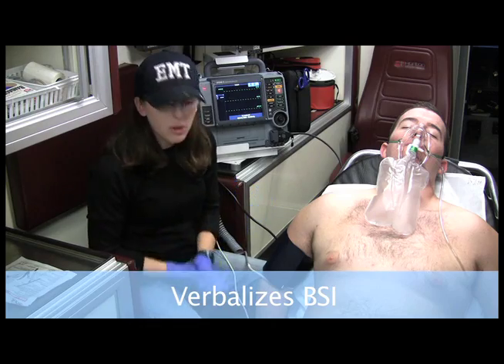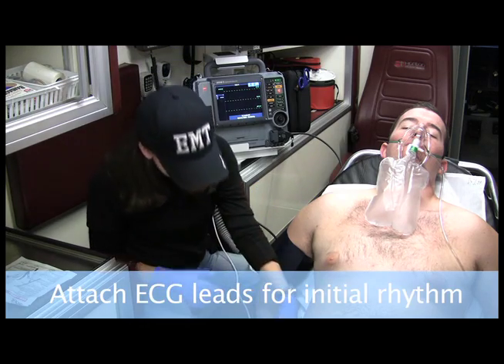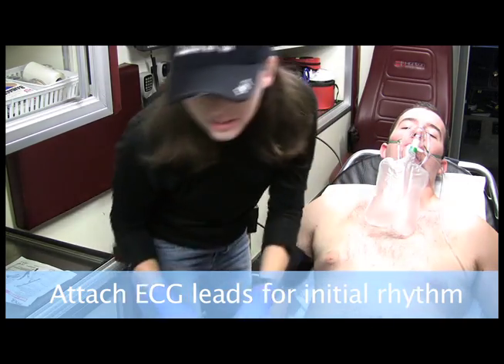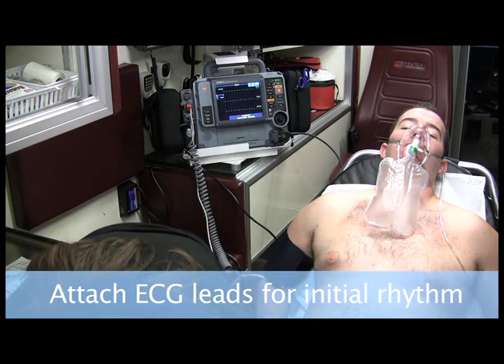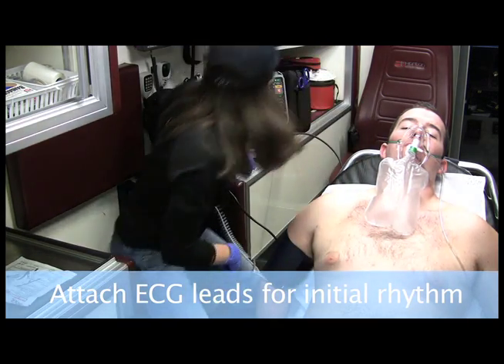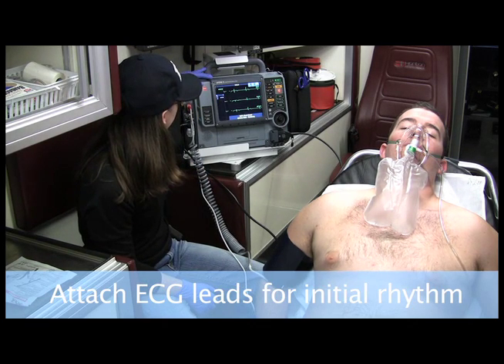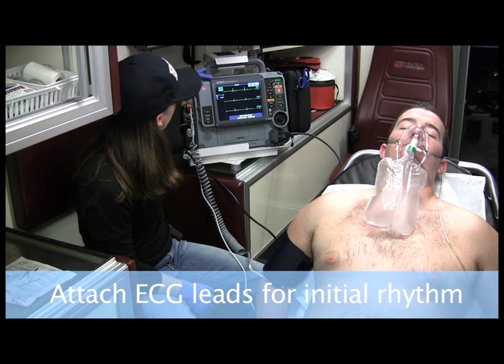I got my BSI on, and I'm going to attach the EKG leads. My monitor has limb leads, so I'm going to attach the four limb leads. And on the monitor, I am seeing what appears to be sinus bradycardia.